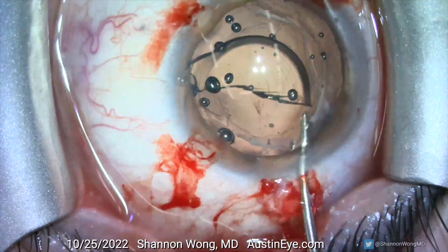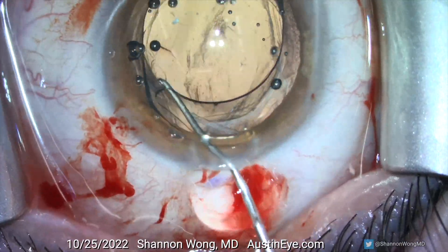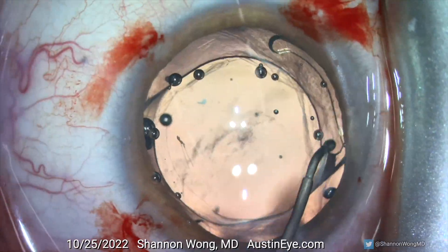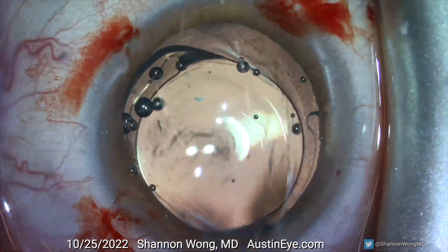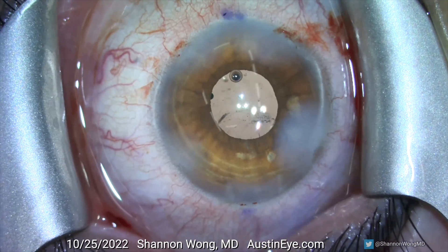There is one additional method for intraocular lens exchange after YAG capsulotomy. Patients that undergo lens exchange around a year or more after implantation may also be able to have the replacement single-piece acrylic lens placed completely into the capsular bag. The capsular bag becomes more rigid and fibrotic month by month and year by year after the primary surgery. Single-piece acrylic lenses can be placed safely and securely inside the capsular bag if the peripheral capsular support is stable enough.